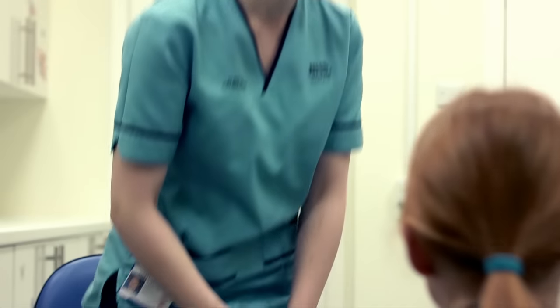Why would I need a breathing test? Well, breathing tests tell us about how well your lungs are working, and sometimes when you're not well, it can affect what your lungs are doing. Right, Susan, we're ready to start now. Do you want to come across to my computer and we can have a wee look at the mouthpiece that we use for the tests?